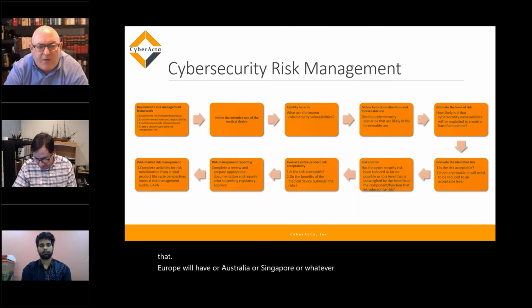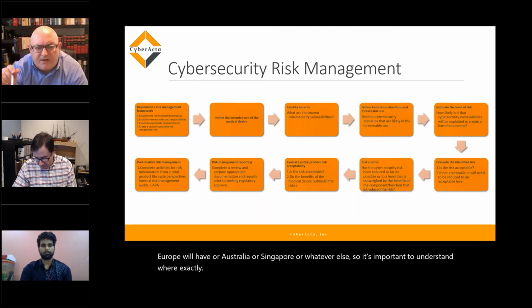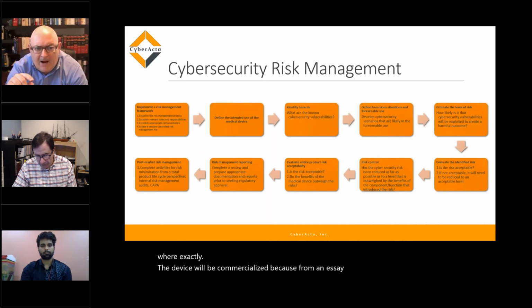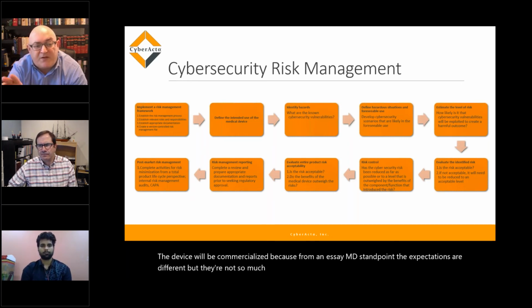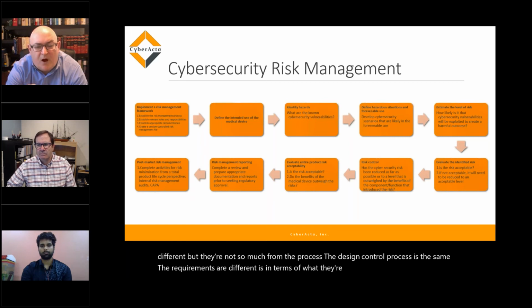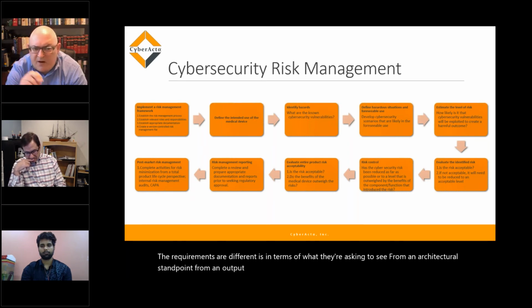So it's important to understand where exactly the device will be commercialized, because from a SaMD standpoint, the expectations are different, but not so much in the process. The design control process is the same. The requirements differ in terms of what they're asking to see from an architecture standpoint and an output standpoint, and there are different ones for each country.